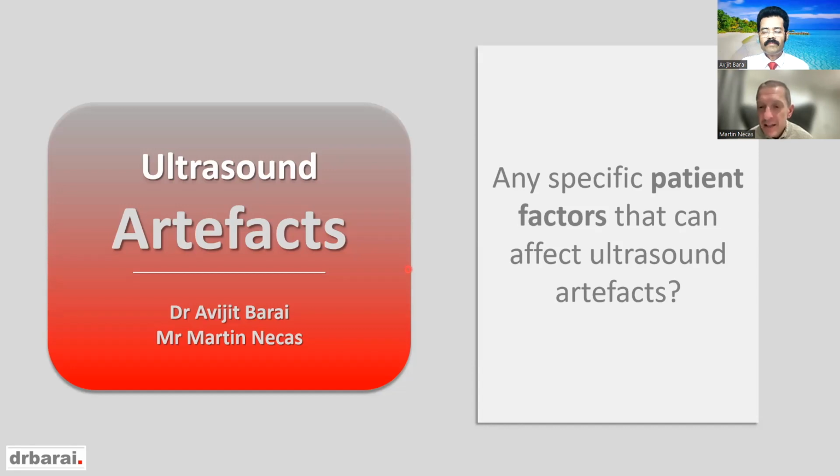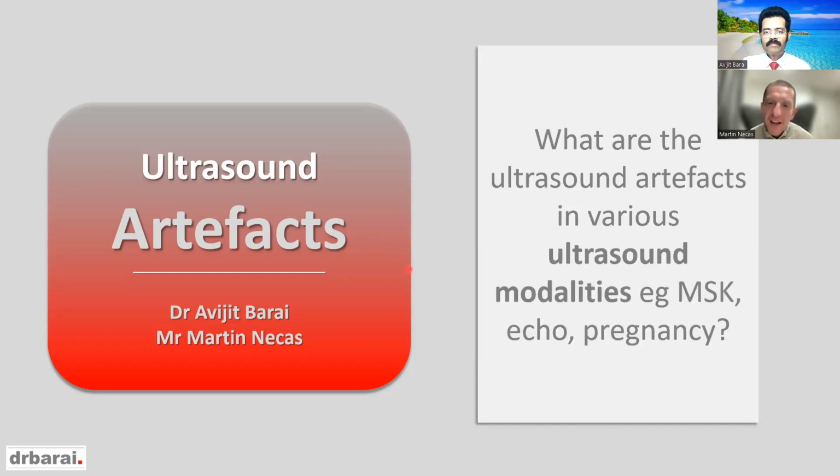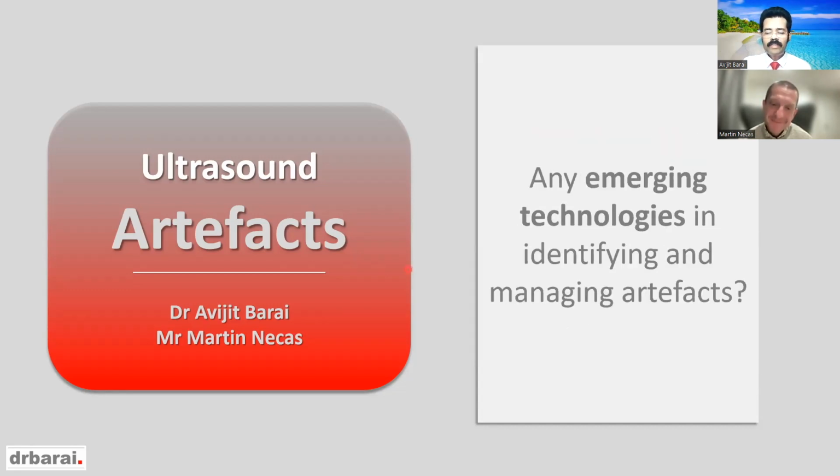I might have someone attenuating. And in fact, you put the probe down and the images are very clear. So I think it's hard to make generalizations. In general, you're right. Bigger people are harder to scan and are acoustically less favorable, but not always. Sometimes you have a child that's very challenging. You really have to be prepared for anything during clinical ultrasound. Absolutely. Yeah, and sometimes a pregnant patient I find quite challenging as well. But again, as you mentioned, it's very, very difficult to generalize about everybody.